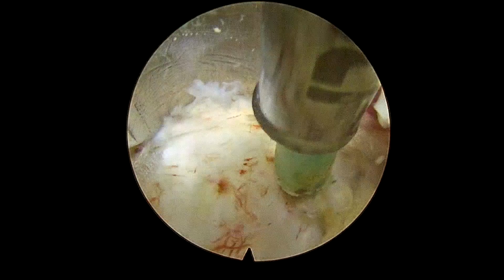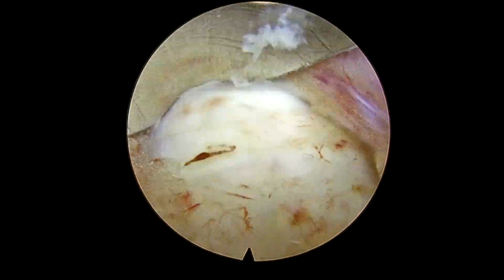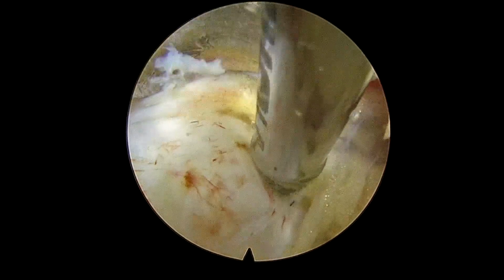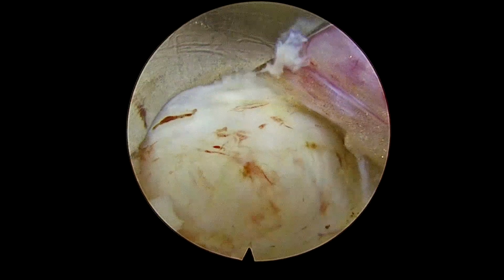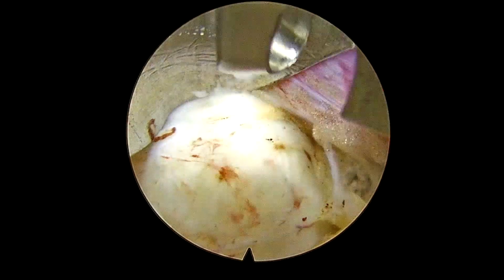Now this is nothing but the disc. So the next step is discectomy here. So we have retracted the traversing nerve root medially with the help of the tip of the working sleeve. So now I am just ablating the epidural vessels over the disc. This is again a very important step. If you start without ablating the vessels, they will start bleeding. So it will certainly hamper your visualization.